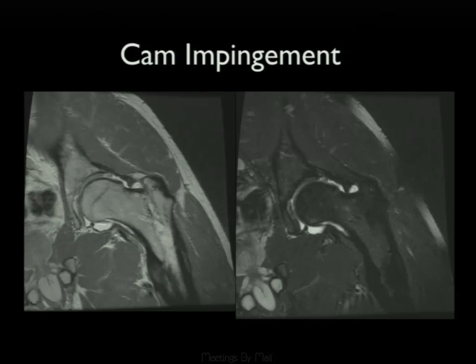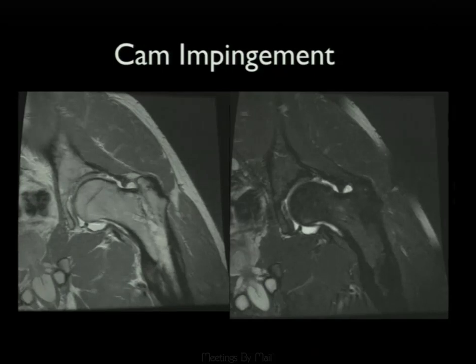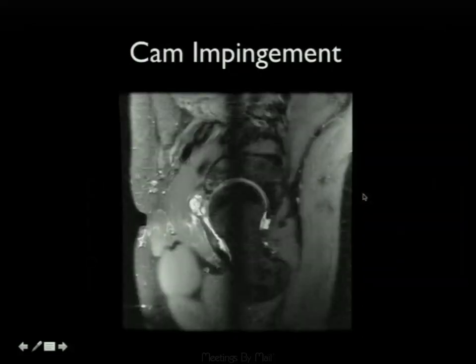In this CAM type deformity, the labrum is degenerated and there is a chondrolabral separation. Contrast may be getting into the deep layer of the cartilage, which may represent a delamination. These types of labral tears often result in complex paralabral cysts seen anteriorly—another example of CAM impingement with a complex paralabral cyst.